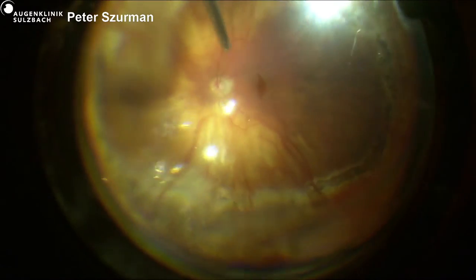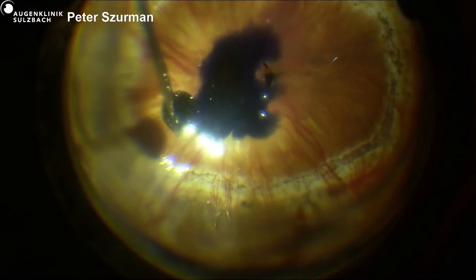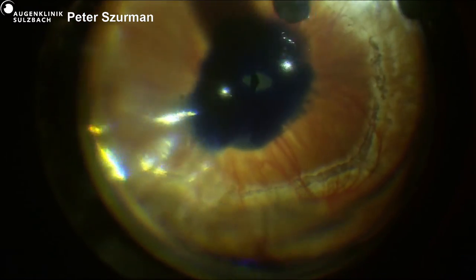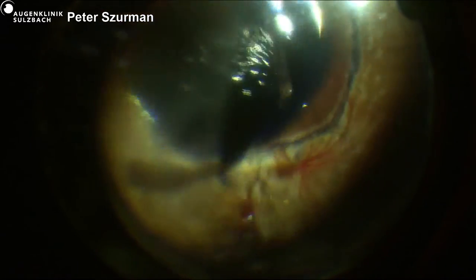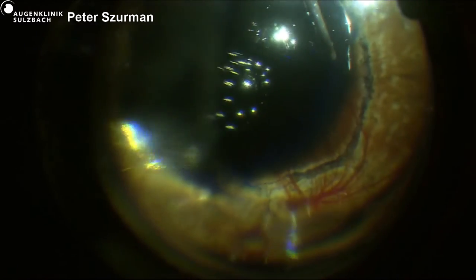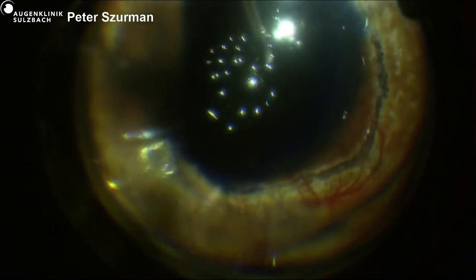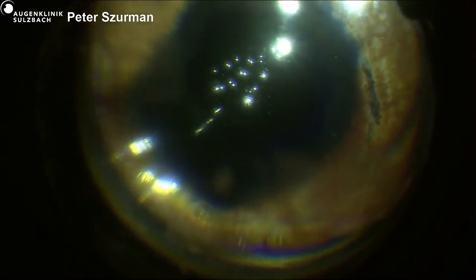Normally, I don't like to drain fluid through a macular hole if we have a macular hole associated retinal detachment, but this defect is so large that it doesn't make sense to apply a retinotomy and look, it goes under the retina. I think it's not avoidable, but maybe we can discuss how to avoid that the staining fluid enters the subretinal space. Grazia, do you have an idea?